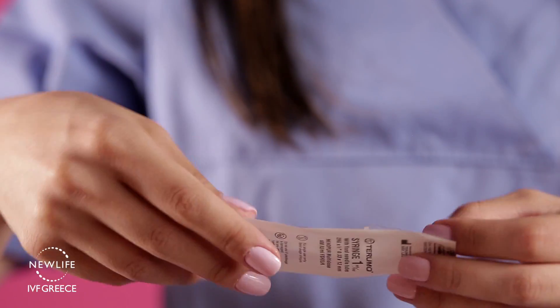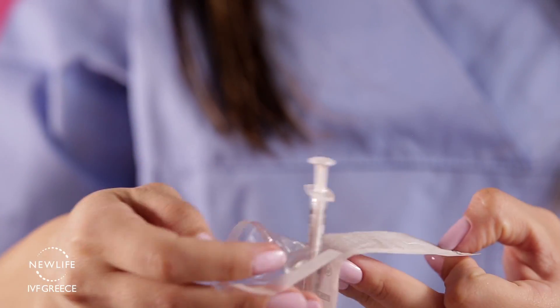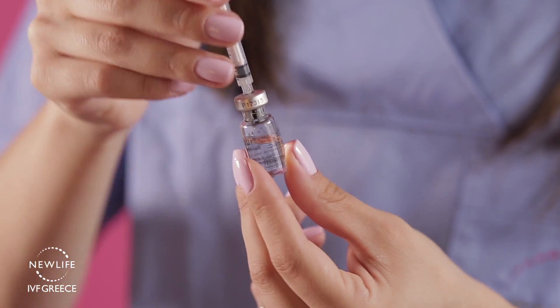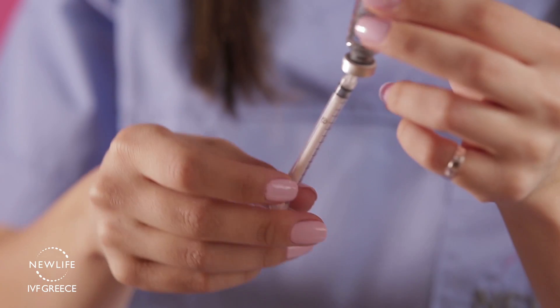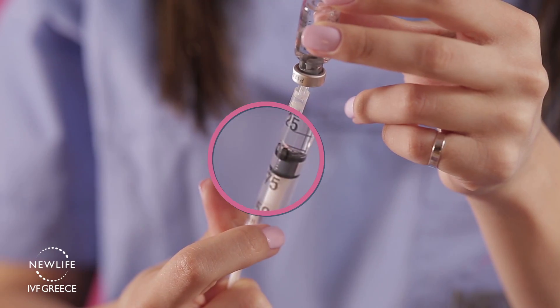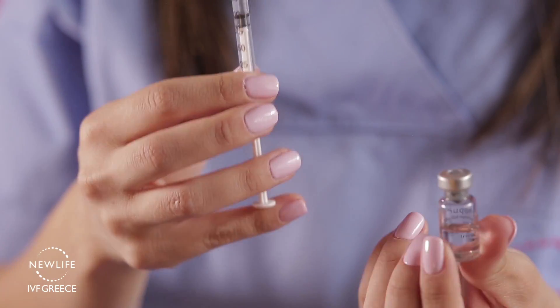Your dose is measured with the single-use administration syringes included in the packaging, and one syringe is to be used for each daily administration. Take the administration syringe, insert it into the vial, and invert the syringe together with the vial. Draw the exact amount of units you are instructed — in our example, 300.